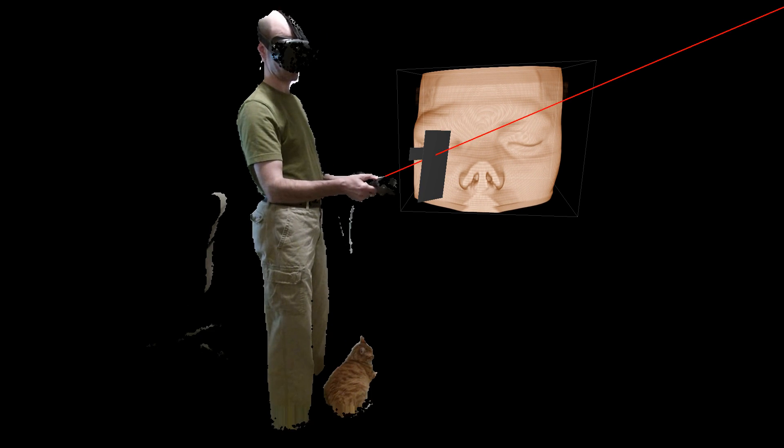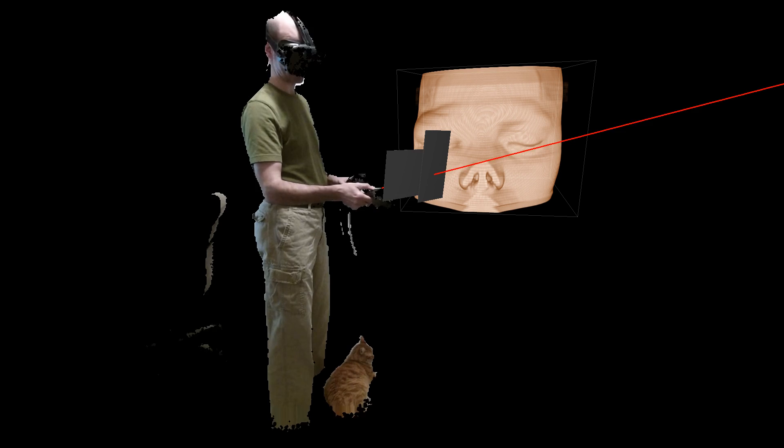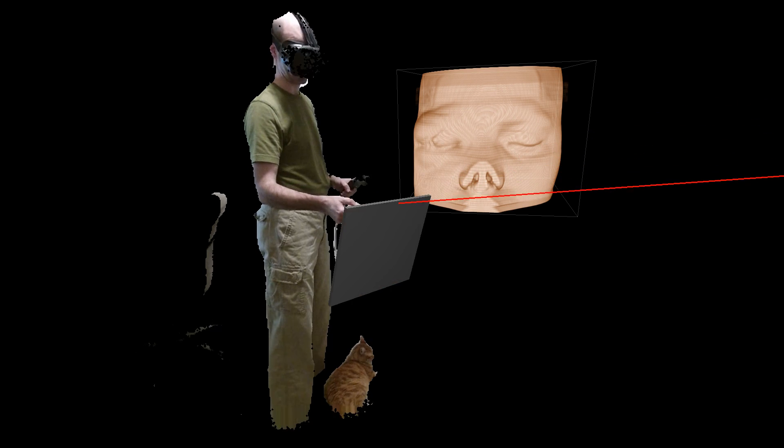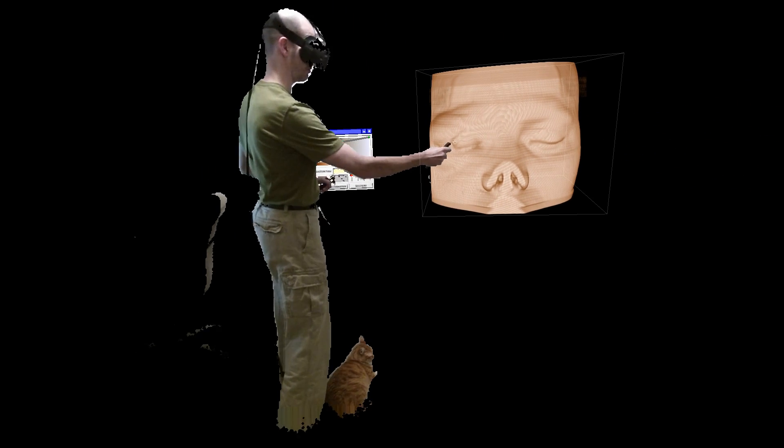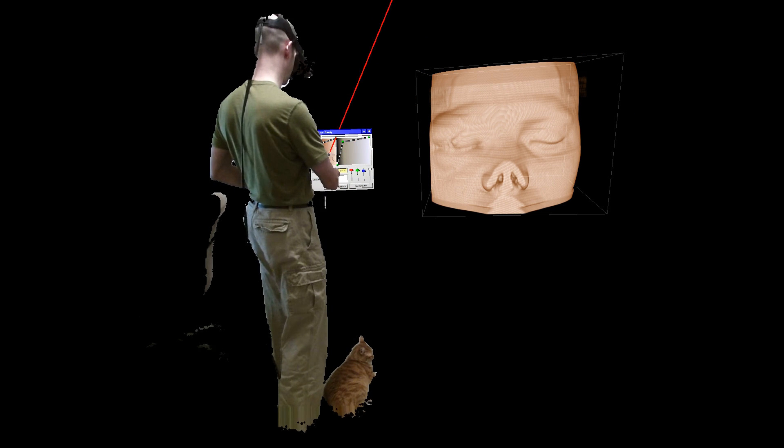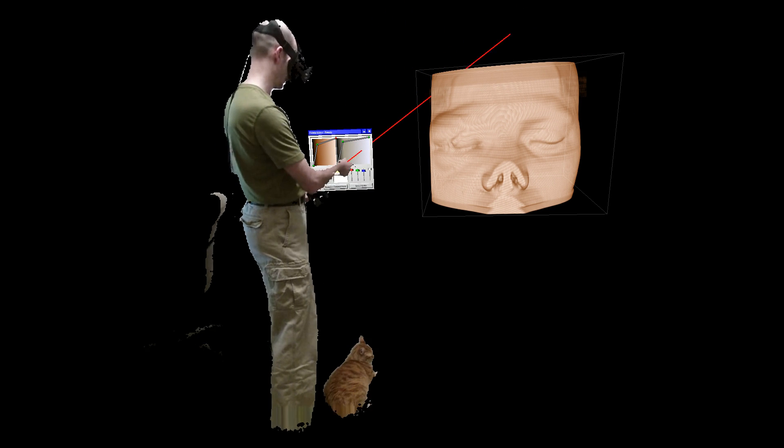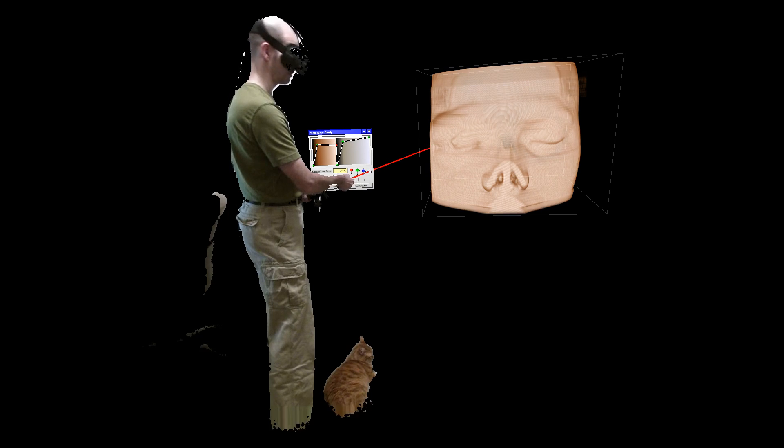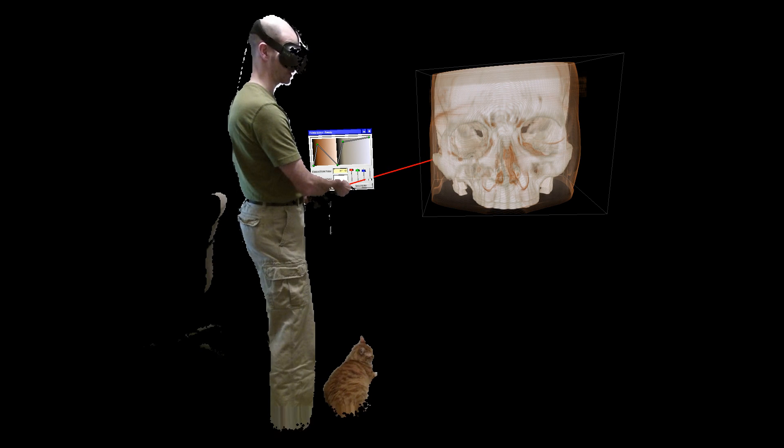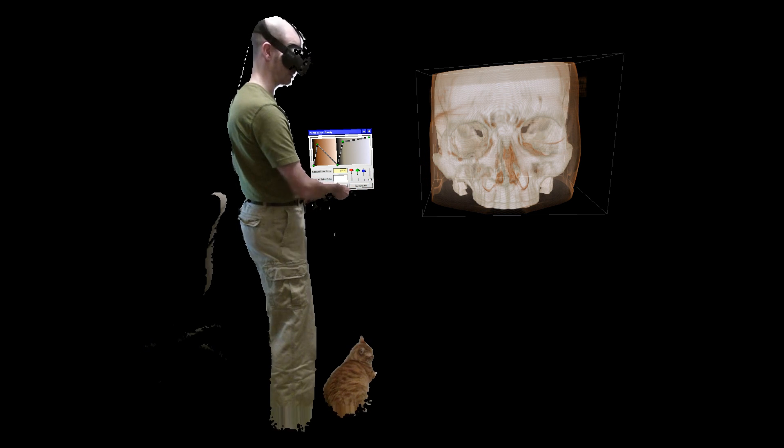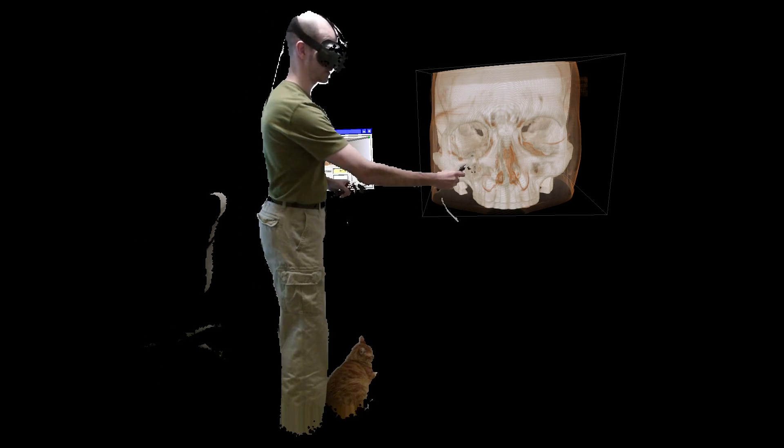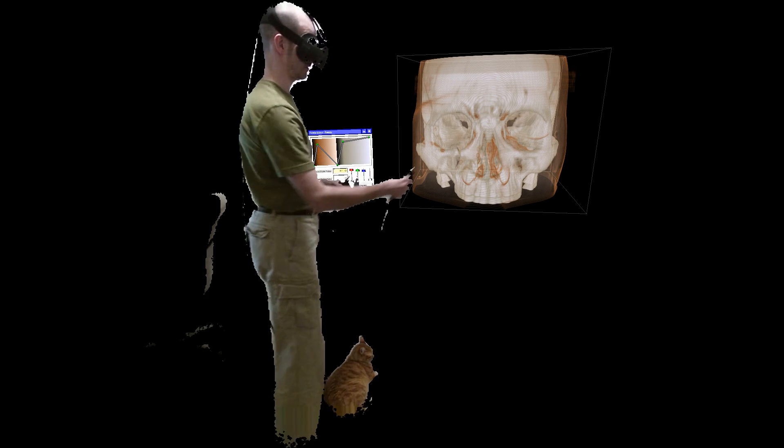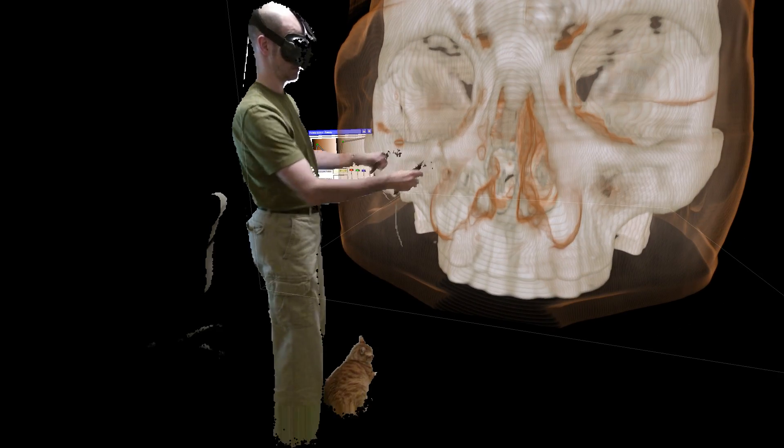So now to look at the inside, I'm going to adjust the way how this dataset is drawn by changing the opacity that is assigned to different data values, in this case tissue density. So I'm going to make the soft tissue more and more transparent, and we can see now the skull, the bones, and you can still see sort of this faint outline of the skin.